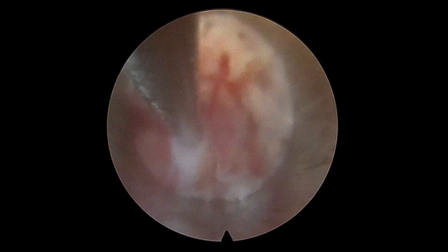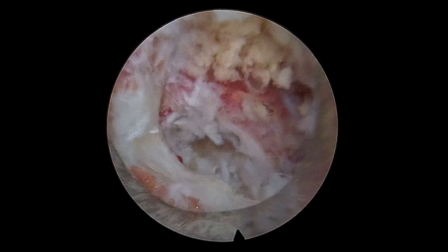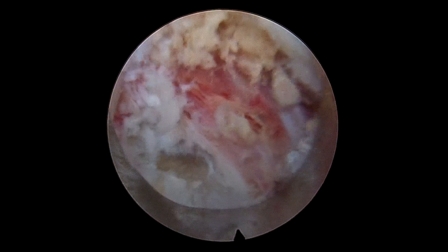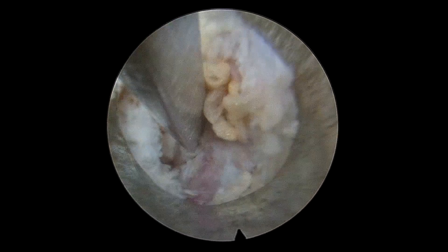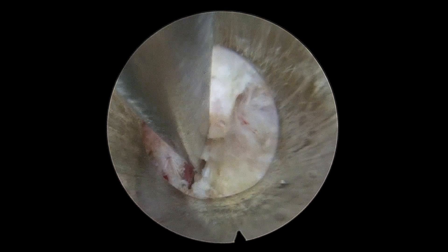Finally, we checked for any more fragments, which were not found, and we were quite satisfied with the decompression achieved. Here we are checking the mobility of the root both cranially as well as caudally.